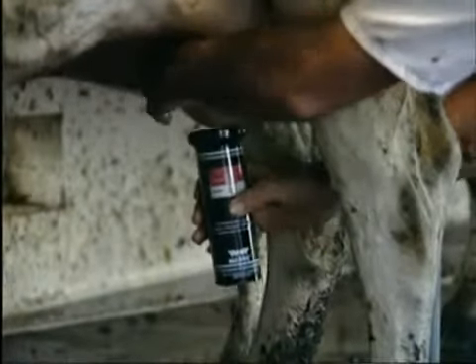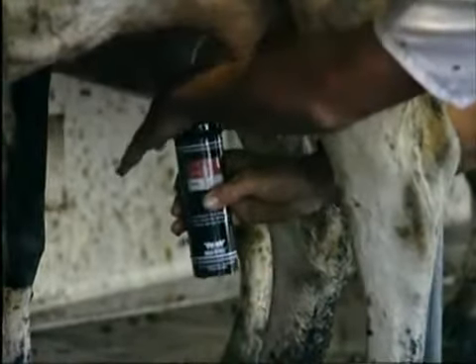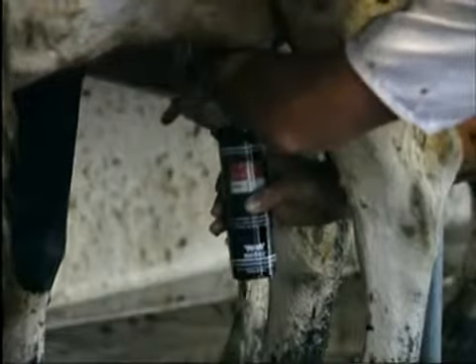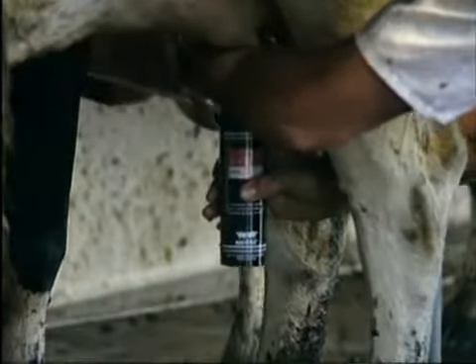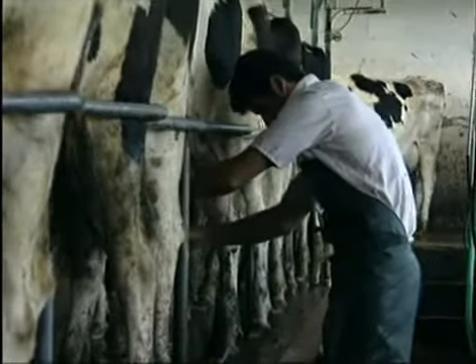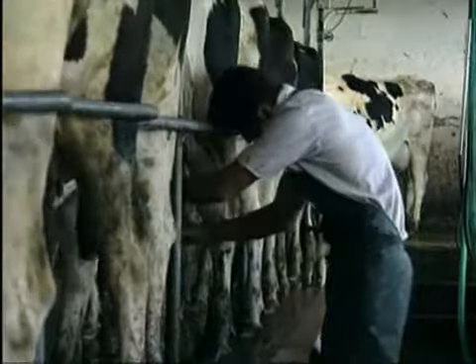Remember, what you are really looking for is the difference quarter. The red abnormal level should be taken as a guide only. Mastitec reads the conductivity of the milk as it passes through the internal cell. This flow-through ensures a quick, accurate reading. Scientists have shown that conductivity is an accurate and reliable indicator of infection — better, in fact, than cell counting.